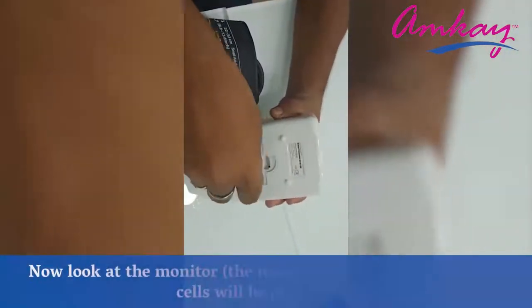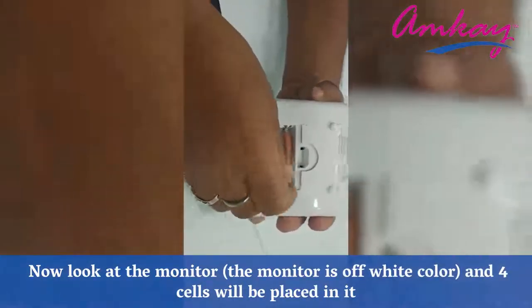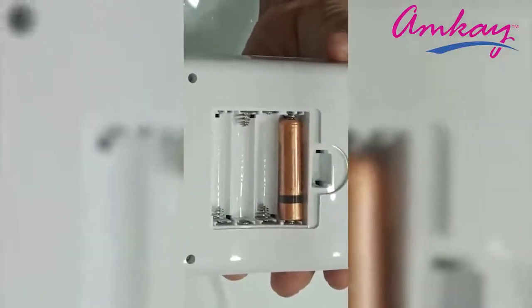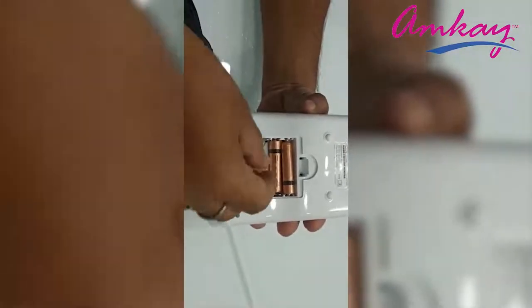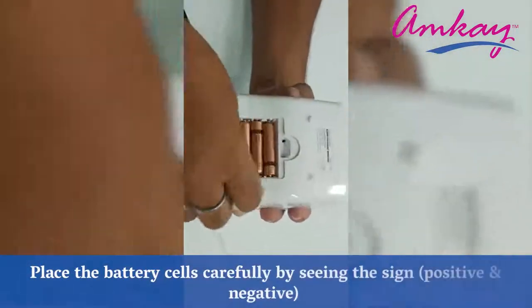Now look at the monitor. The monitor is off-white color and 4 cells will be placed in it. Place the battery cells carefully by seeing the sign — positive and negative.